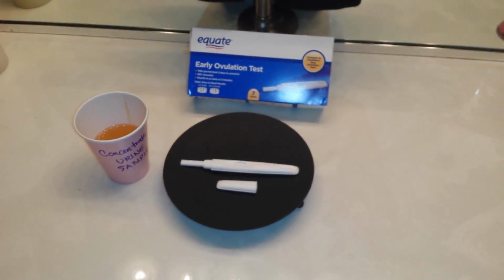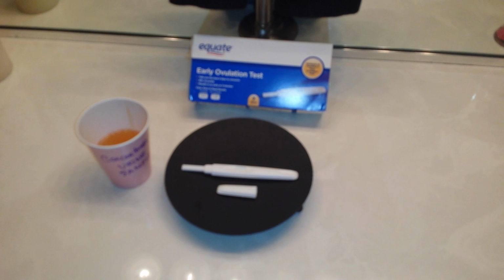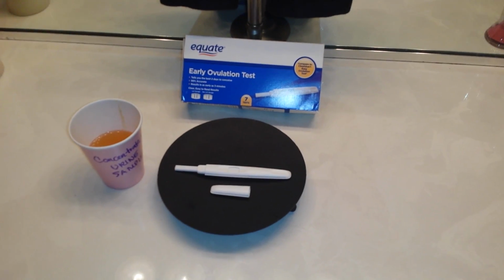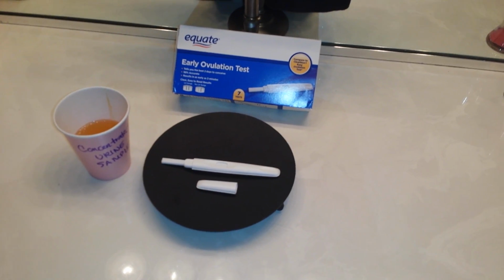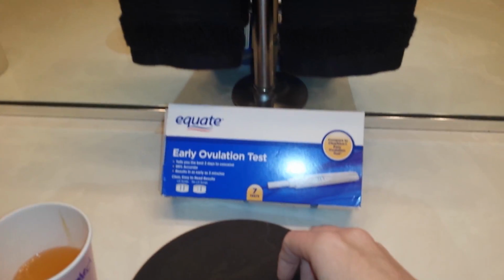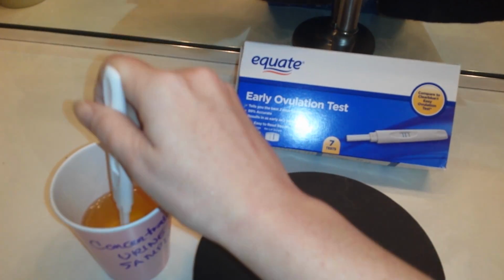So I'm going to go ahead. This is my cycle day 36, and I'm going to dip the stick and see if it yields another positive for me. If you were watching yesterday, it was another blazing positive, and I did this test in conjunction with the Dollar Tree brand New Choice, which is 25 MIU. But this is supposed to be 100 MIU, again, according to consumer studies.